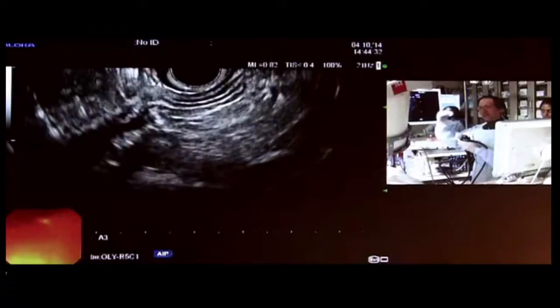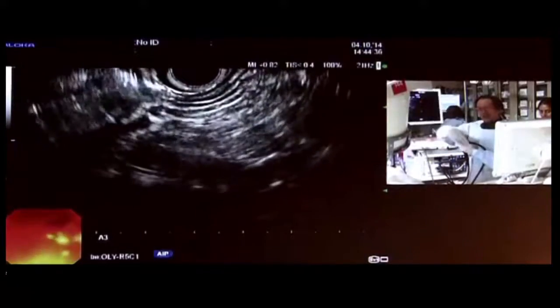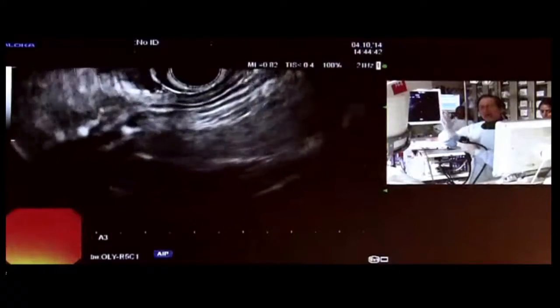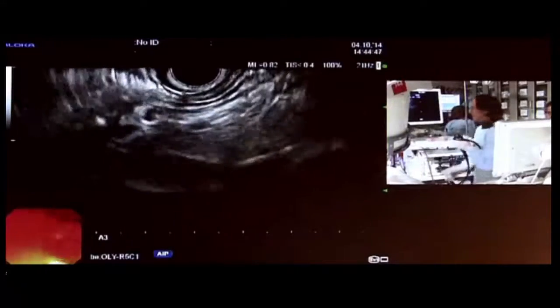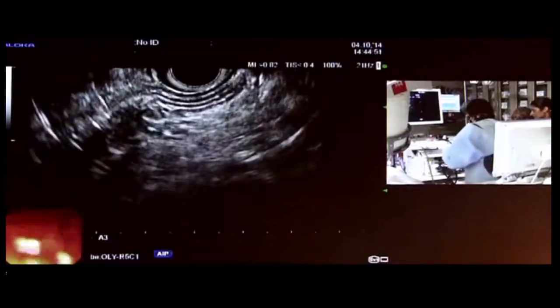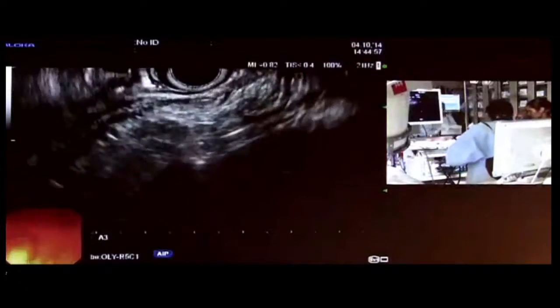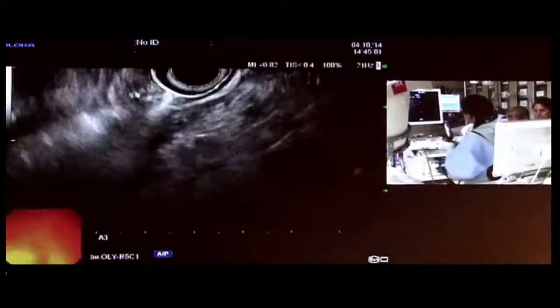So I like to, if possible, access the genu, because that's where it dips down into the head. And there I have sort of an extrapolation of my needle path so that I will land nicely inside of the duct. So we'll take the 19 gauge needle, and we have an expect needle here, right? Yes. So this is the Nitinol one. 19 flex, yeah. You're in the antrum there or in the body? No, we're in the body.